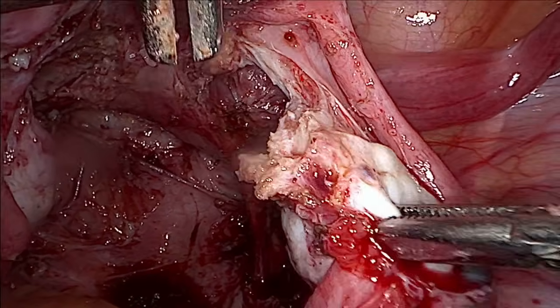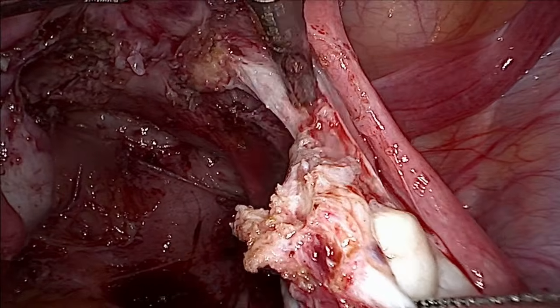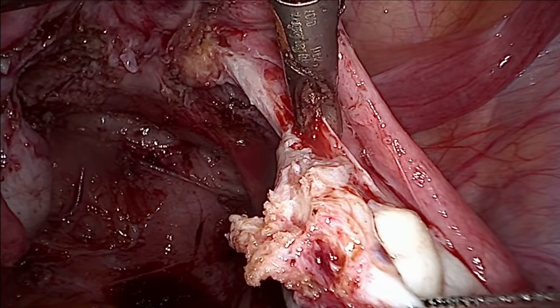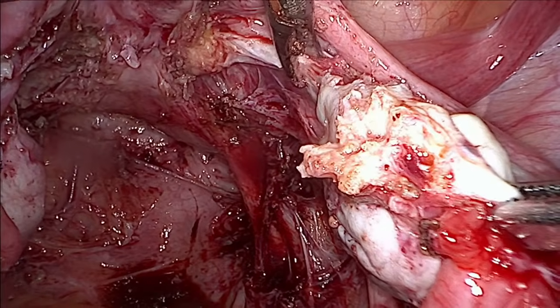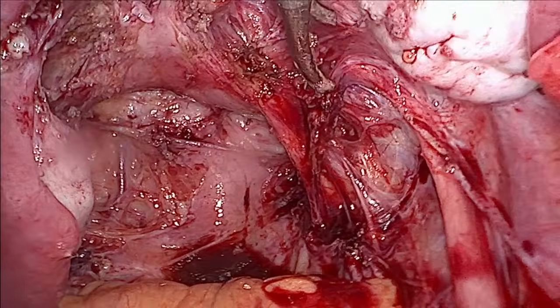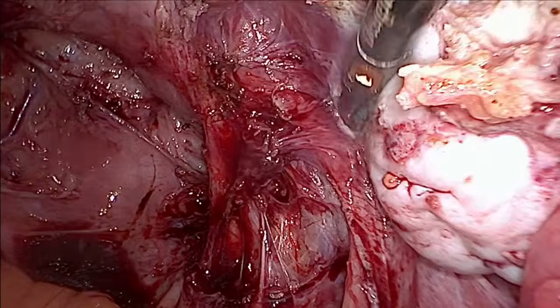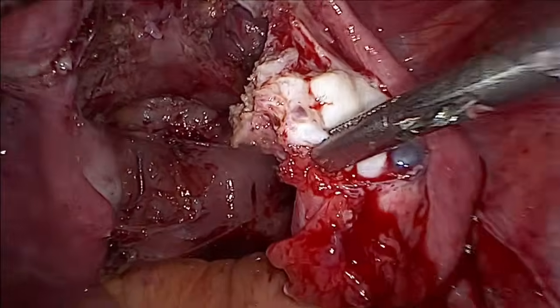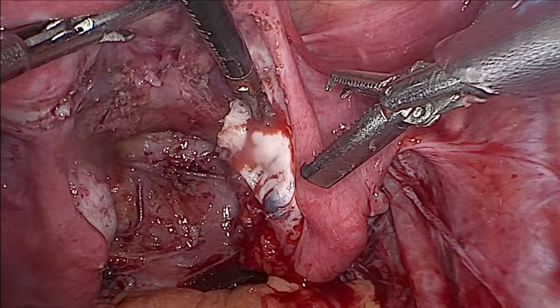This adhesion has been released here. Okay, you can see it's quite free. No need to go further. Okay, it has been released from everywhere. You can see the uterus going. Now comes the important part.